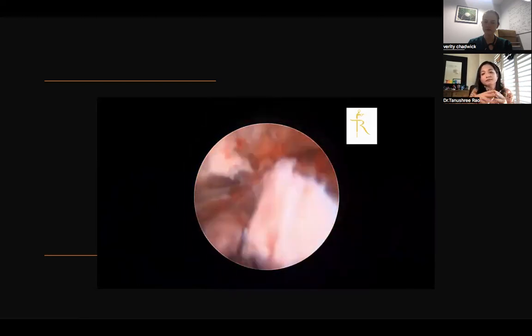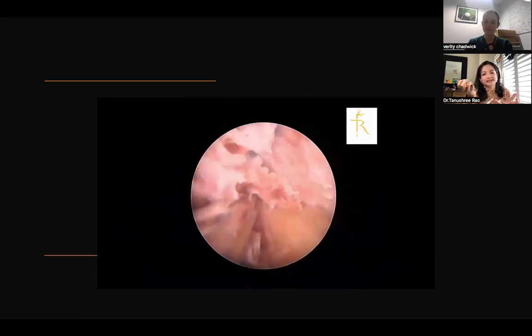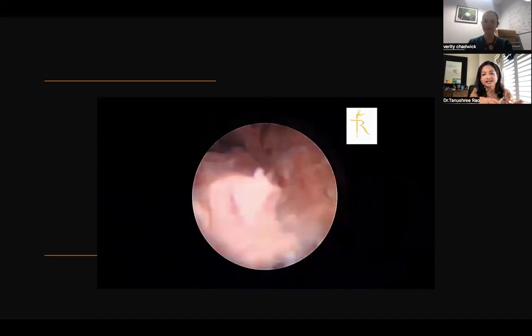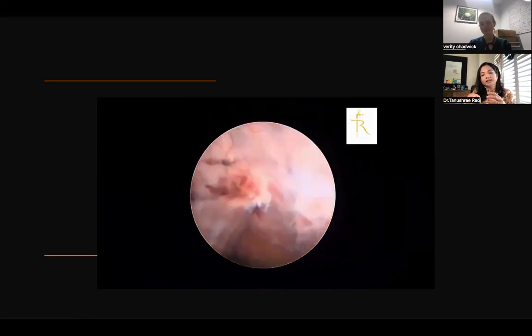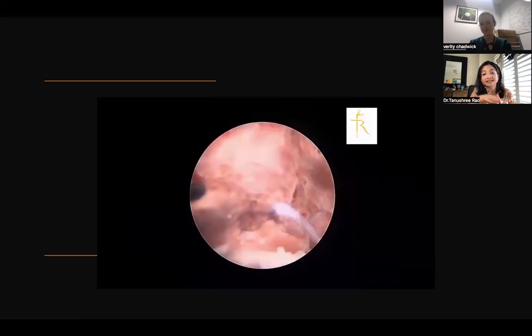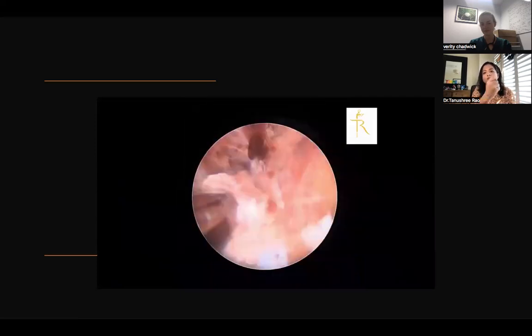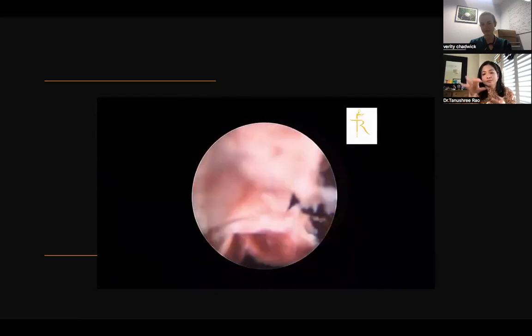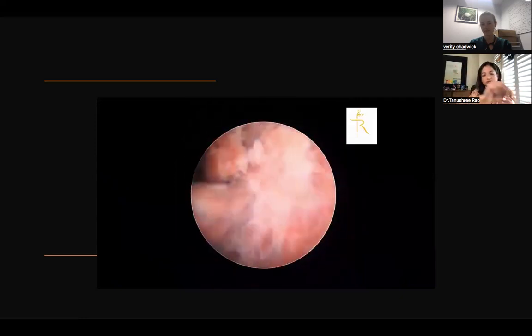And right now, I'm using an operative hysteroscope, which is called a tissue extracting device, okay? I'm not going to take names, just to be politically correct, but there is an instrument that can take away the tissue and has a containment system so that it doesn't flood your operating field. This is very useful because in the past, with older generations, you would probably use a resectoscope, okay? Yes, it does the trick, it takes out the tissue, but then leaves the tissue still swirling over there. So then you have to take the entire hysteroscope out, grab out the tissue, then get back in.